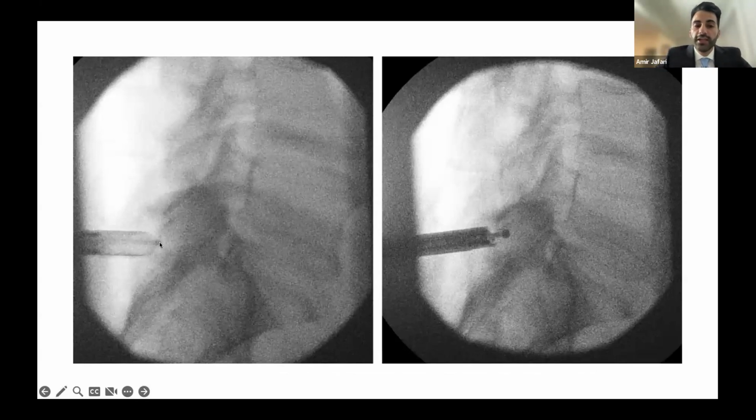A trigger flex device is used to make a slit and go over the tissue. Our goal is to avoid damaging any muscle. So we make a slit and try to create a flap and get under any muscles. We don't want to damage any muscles. That's the whole point of doing this endoscopic procedure, to prevent destruction of the supporting structure of the spine.